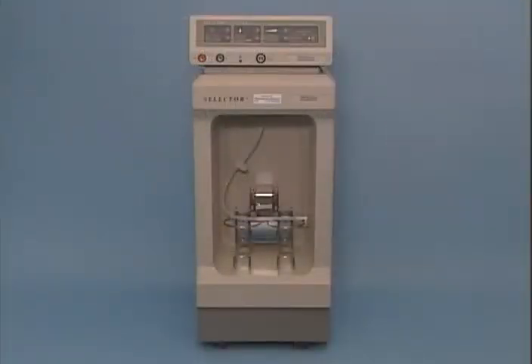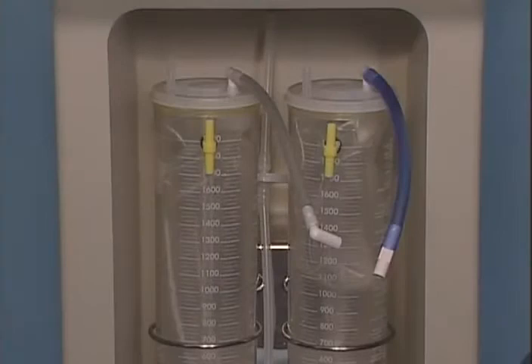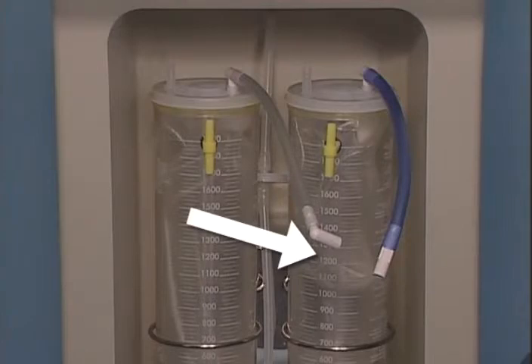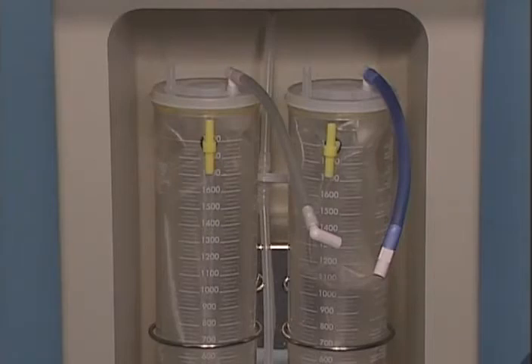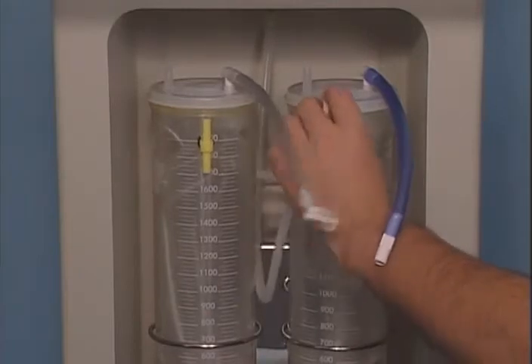When surgery demands the use of 2 receptacle canisters, the following directions are recommended. Step 1. Place the filtered Abbott liner with blue tubing into receptacle to the right. Step 2. Place unfiltered liner with clear or white tubing into receptacle to the left. Make sure that the liners are well sealed to the canisters. Step 3. Connect the vacuum port tubing to the top of the yellow T on the filtered canister located on the right.